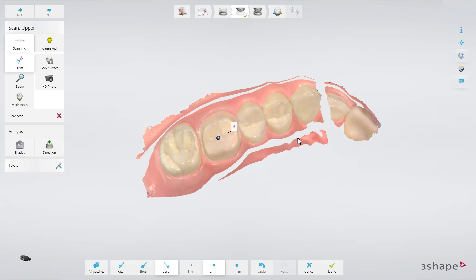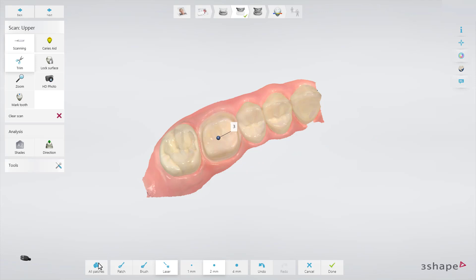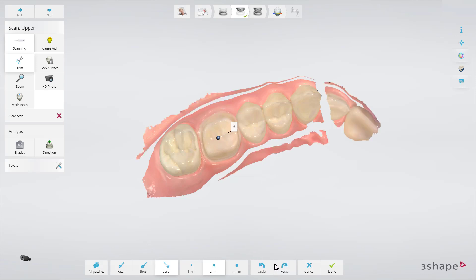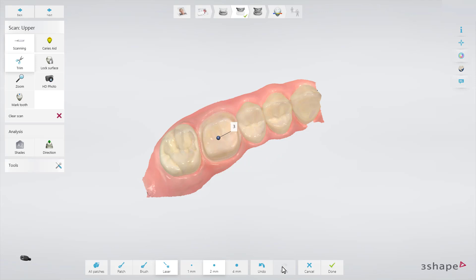You also have the All Patches tool, which automatically removes all elements that have slim or no attachment to the main surface. To cancel or restore the last action, choose the Undo or Redo options. To close the trimming tool without any changes, choose Cancel. If you are satisfied with trimming and want to accept all the changes, choose Done.